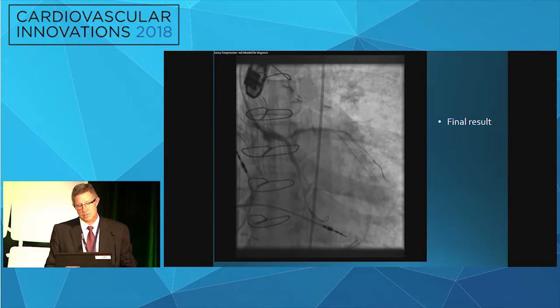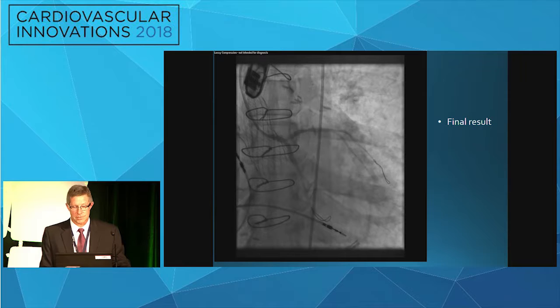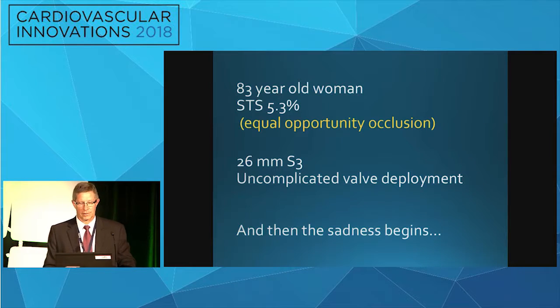And so I wired that other OM. Now that's through 2 stents that os comes through. That was ballooned and stented again. He did great when you open up that other OM. So you don't always exactly know what has to be fixed all the time, and thinking you get one vessel done is often not quite enough.